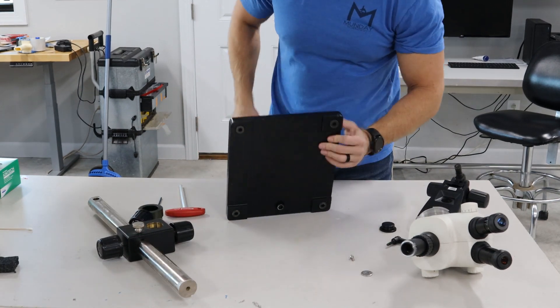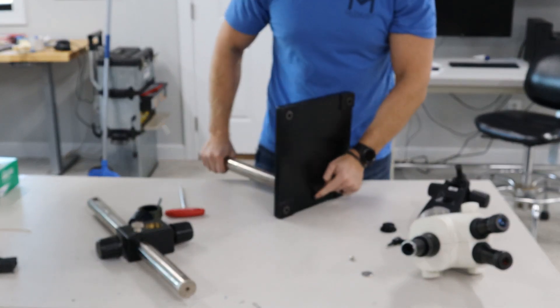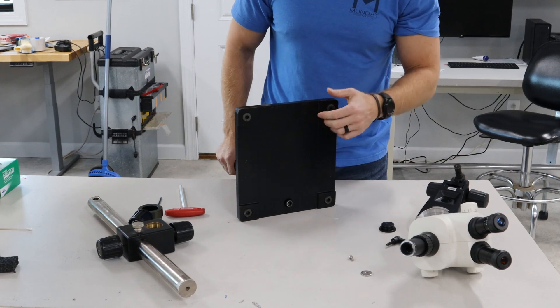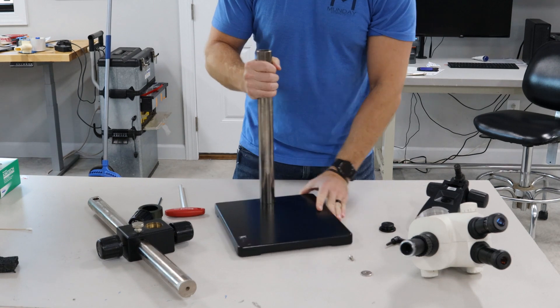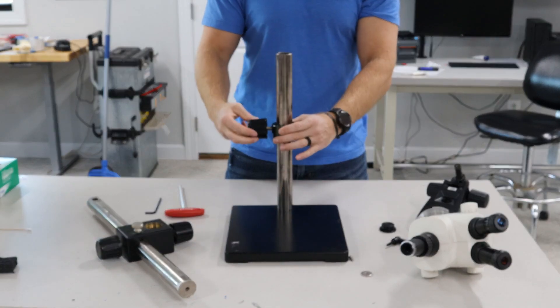You want to put this post — there's only one hole that it'll fit in. Kind of align them, screw this bolt into the post, make sure it's really tight, and set it up.